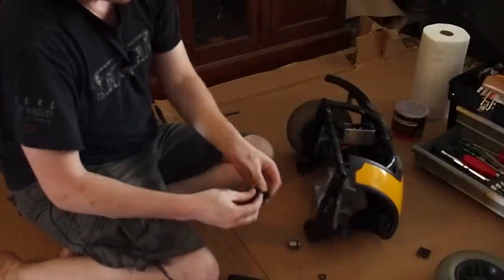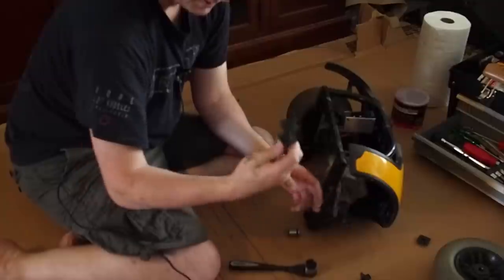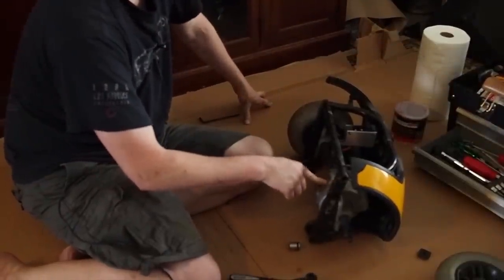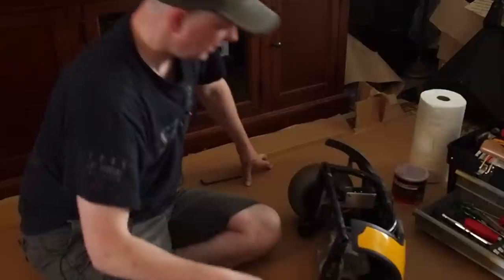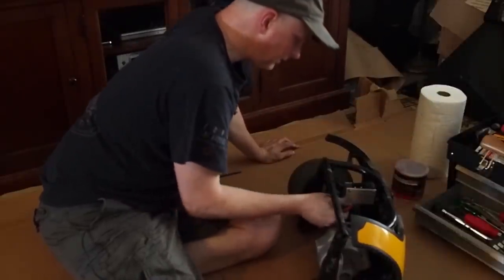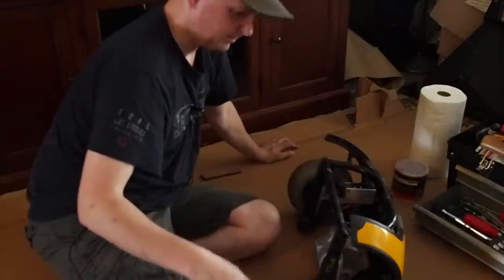There's some washer. This bolt. Washer and a screw on it. Again, I just put them back together like this, just so that you don't lose any parts. It's really going to be important to keep track of things when you take apart the transaxle, because as like I did, you probably will misplace things. So there, I undid the wire there. So this wire is connected to this piece. So in order to get this off, I'm going to have to take this off as well. I was hoping I wouldn't have to, but apparently I do.